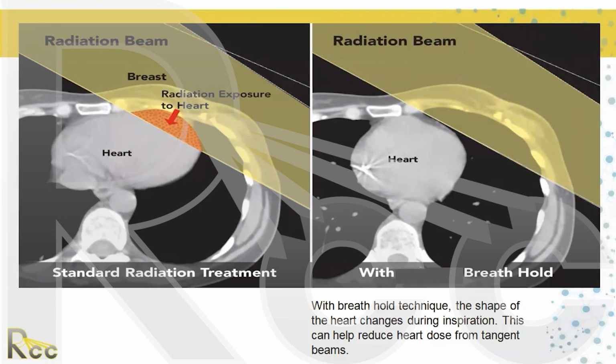If you want to talk, I also see that you have a question in the chat. If you want me to just read that, yeah, I'll just go ahead and read it. So they ask, what is the difference between TrueBeam Linac and Varian Linac?